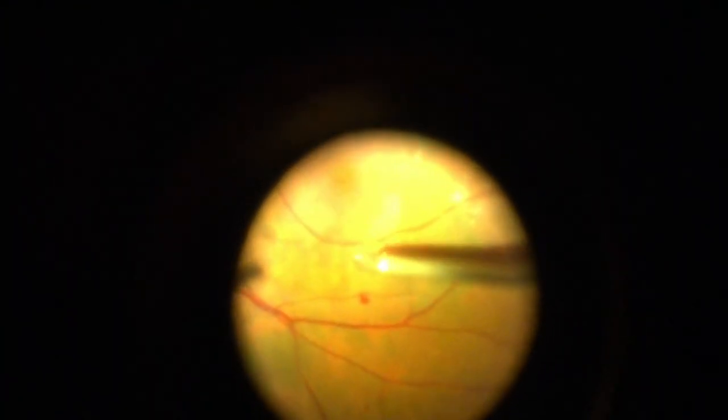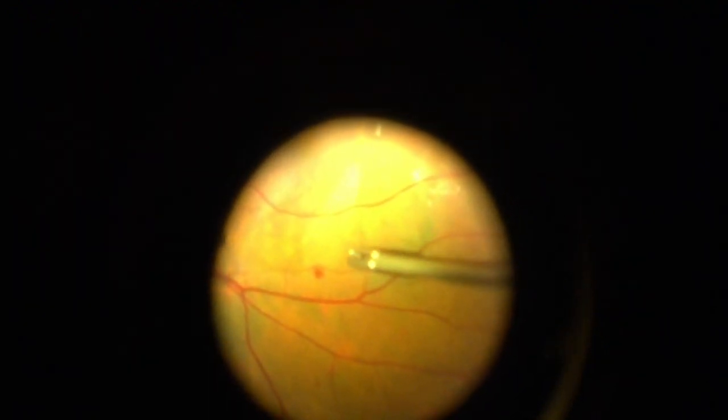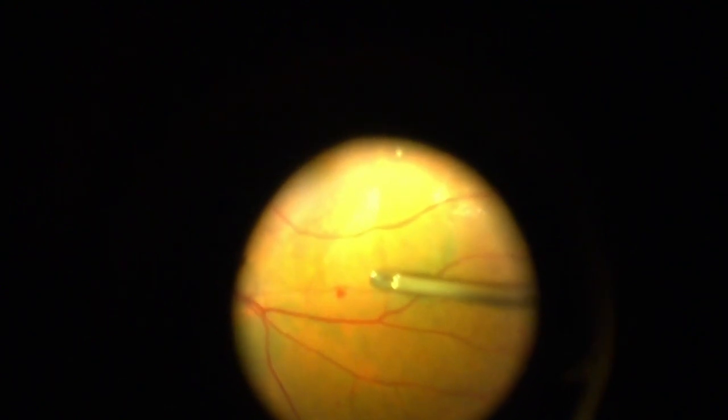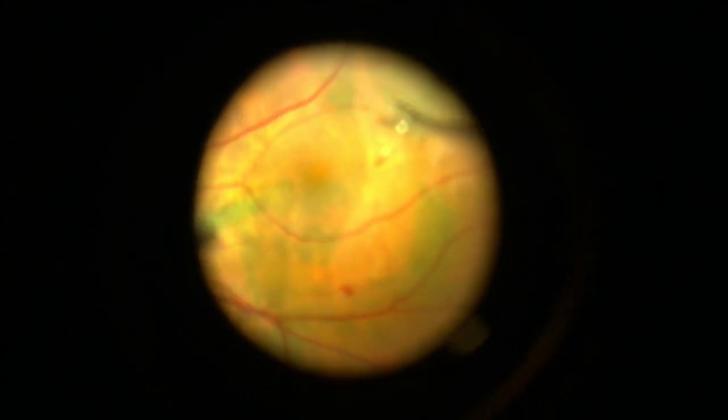So now we got a peeled spot here. It doesn't stain quite as well because the ERM was blocking some of our stain. This is more of a jigsaw puzzle piece missing here, which is kind of nice. It's easier to see the edge. We can go down and pinch that edge and grab it. And notice how I'm peeling away from the central macula. I try to stay around the outside. The centerpiece will come up. Now you can see an even larger piece missing, right? It goes all the way from here to here, kind of a kidney-shaped piece.